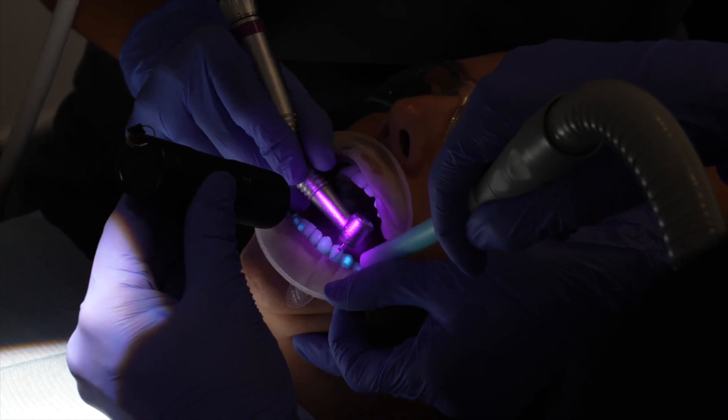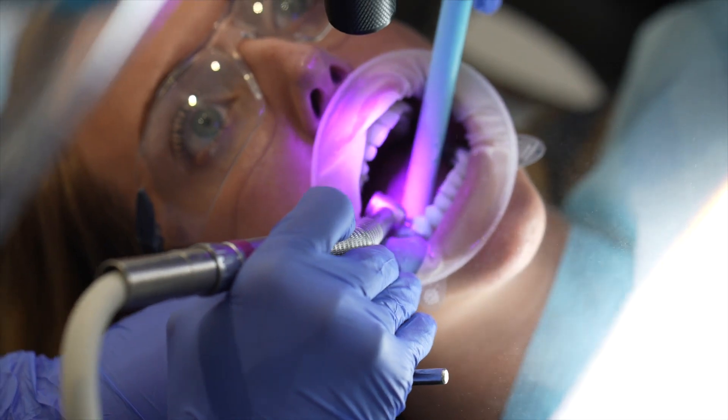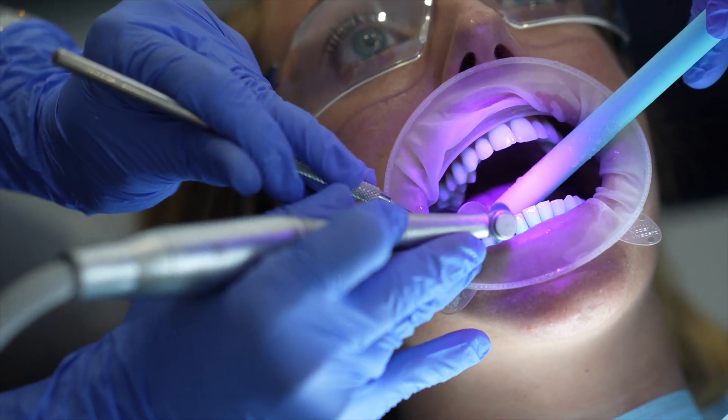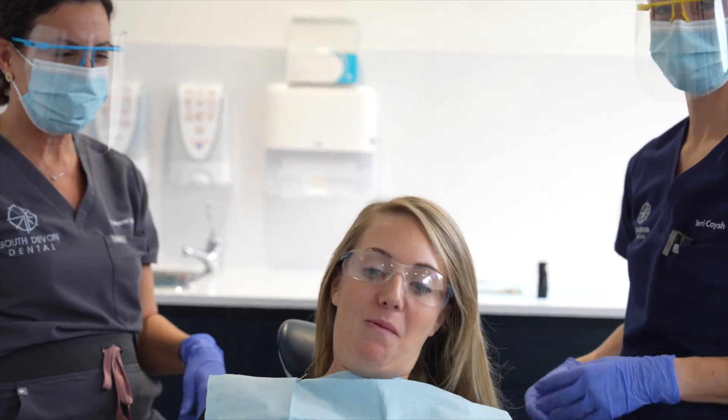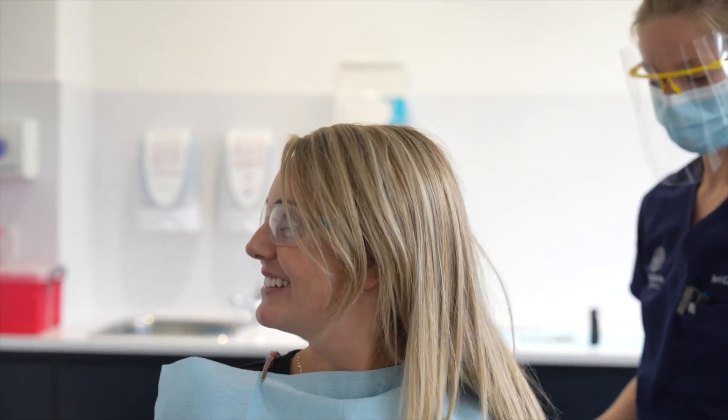Sami wore the aligners for six months and the attachments showed great stability, which is due to the filler content of the Aligner FlowLC. How do you feel now without the attachments? They feel really smooth.